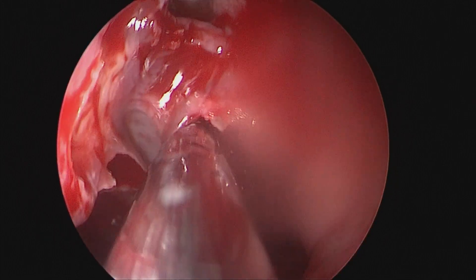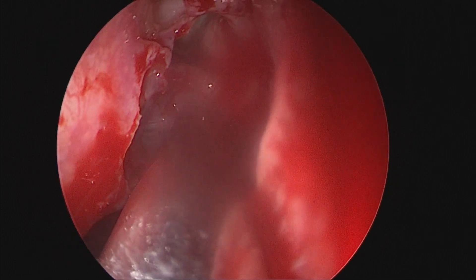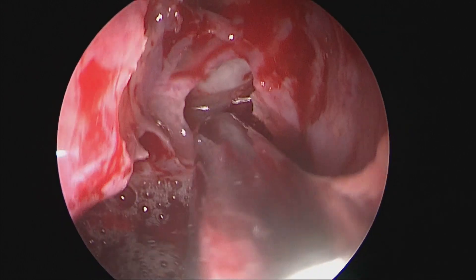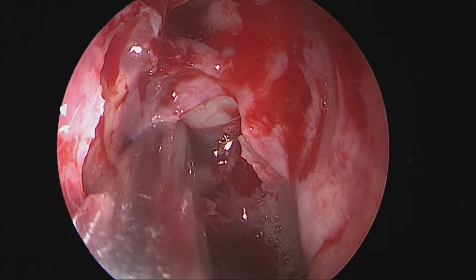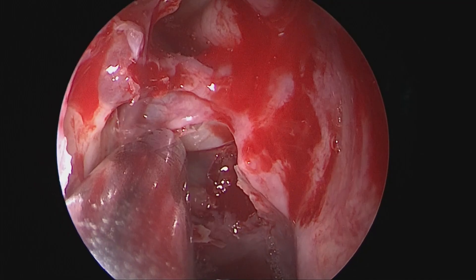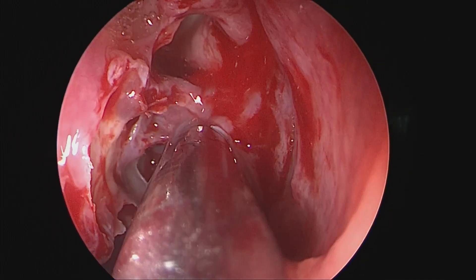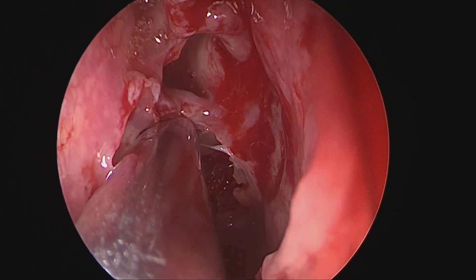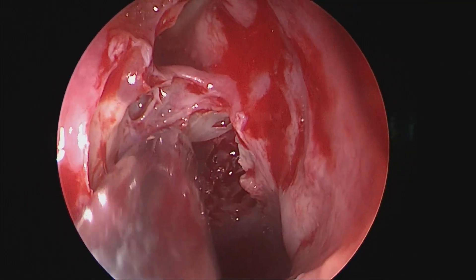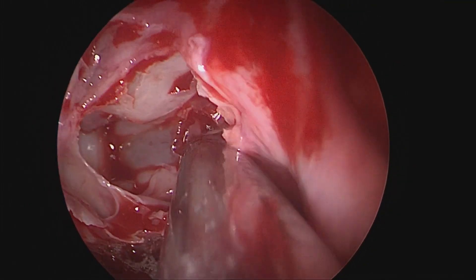We will take a shaver blade — this is the right side — and open the most anterior part of the ethmoid, which is the cell above the buller sometimes. The suprabullar cell, which often in one or more quantity can pneumatize inside the frontal sinus, creates a frontal buller cell often mistaken as an isolated frontal cell or a type 4 cell.